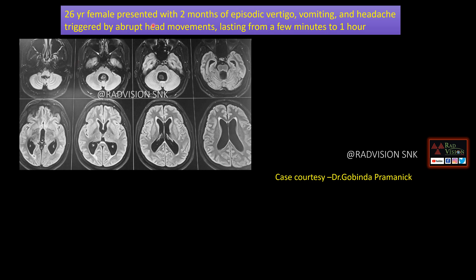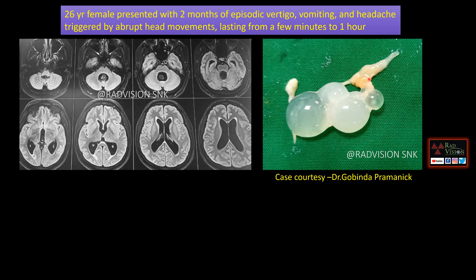Next case: a 26-year-old female presented with two months of episodes of vertigo, vomiting, and headache triggered by abrupt head movements. You can see there is a bubbly cystic lesion noted within the fourth ventricle projecting into its lumen, with supratentorial dilatation of bilateral lateral ventricles and even the third ventricle, consistent with hydrocephalus. These cystic bubbly lesions within the fourth ventricle causing obstructive hydrocephalus in a female with this typical history definitely suggest cysticercosis, which is the most common differential. After surgical treatment, these white bubbly cystic lesions were retrieved from the fourth ventricle.